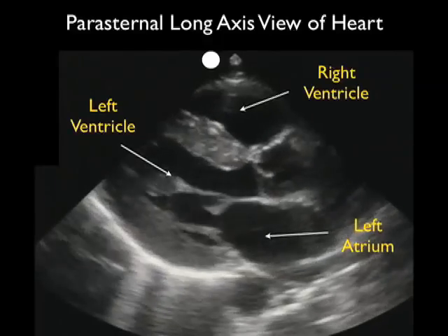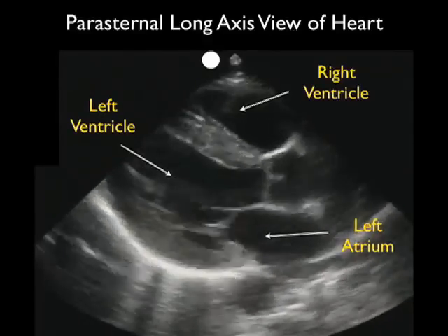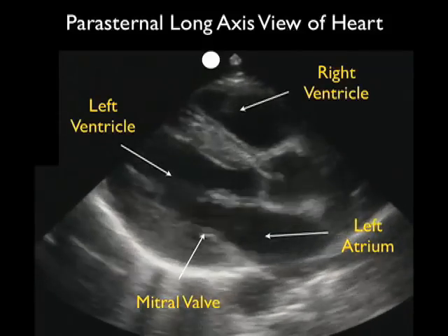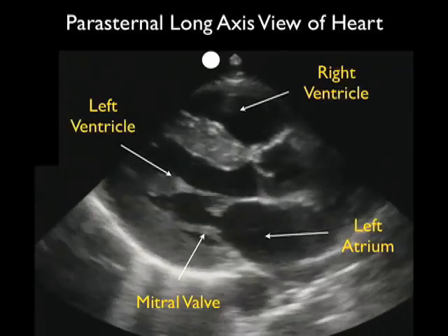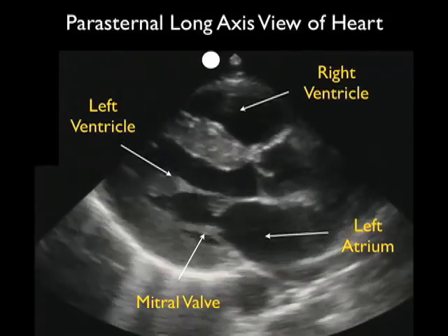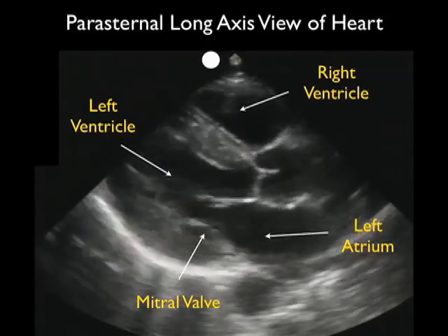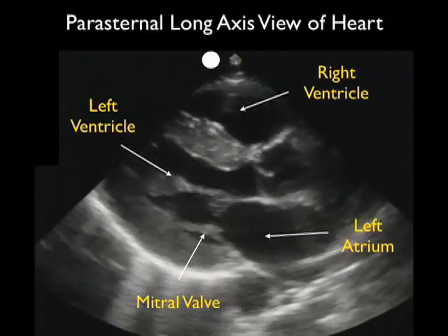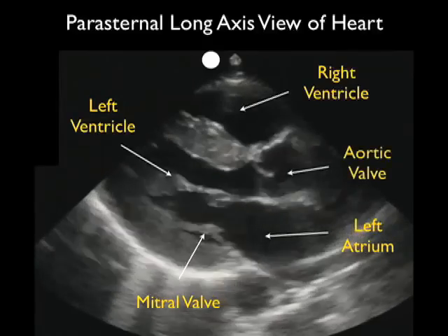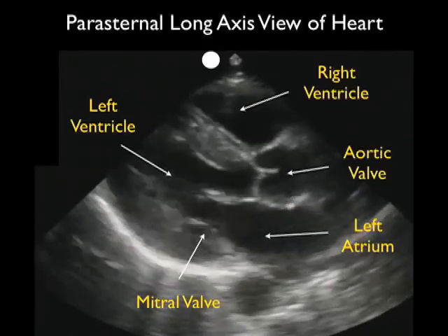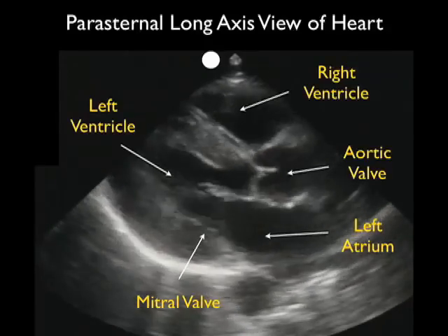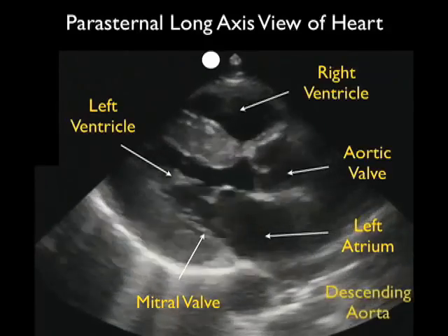We see the left atrium to the right of the left ventricle. Notice the mitral valve flipping up and down in between the left atrium and the left ventricle. Now just above the left atrium and to the right of the left ventricle, we see the aortic valve. And notice there, just to the right of the aortic valve, a little bit of the diamond-shaped aortic root. This will be our left ventricular outflow tract.